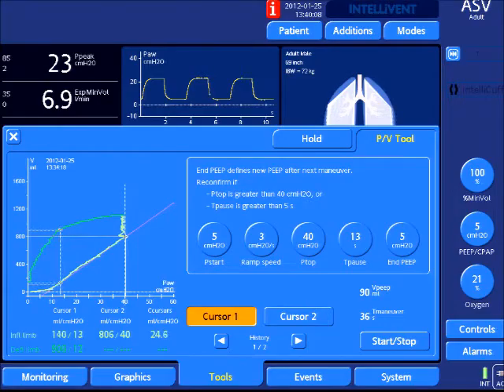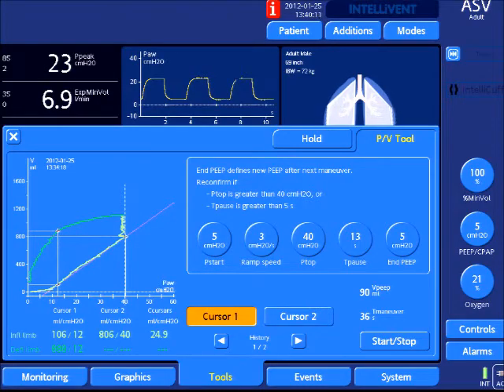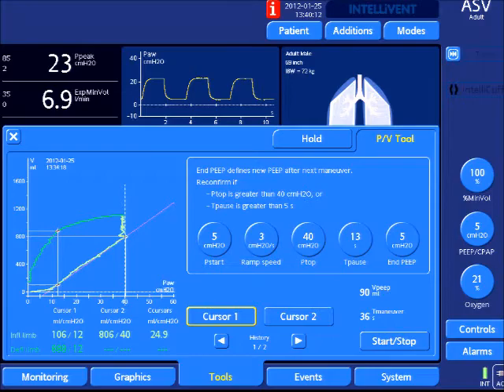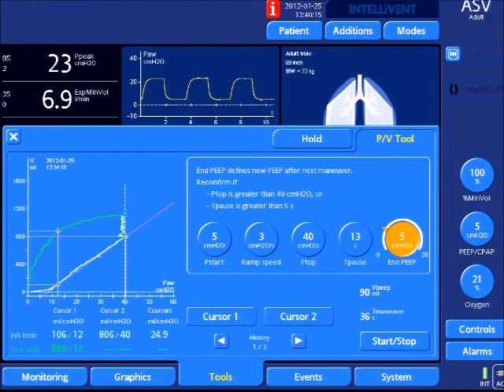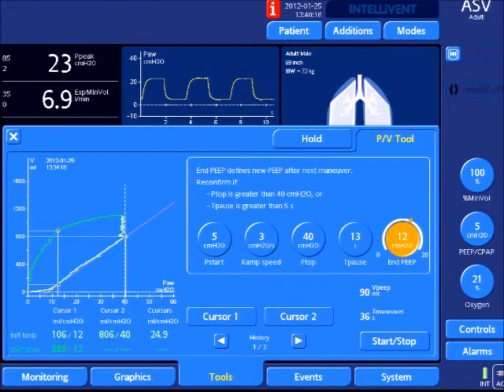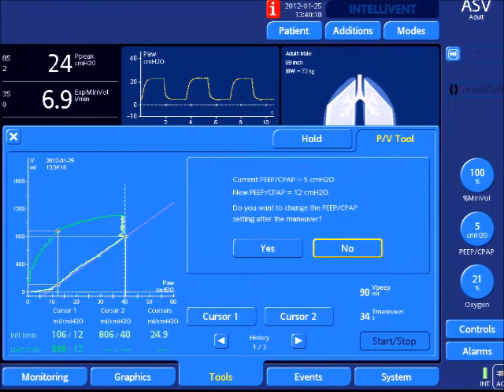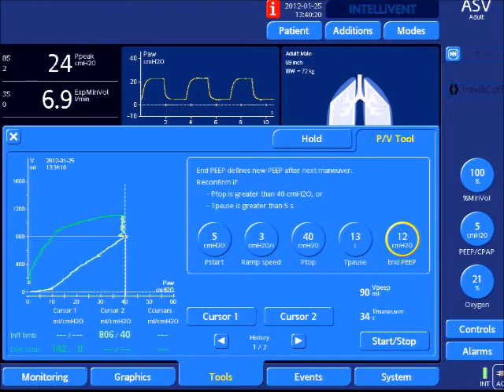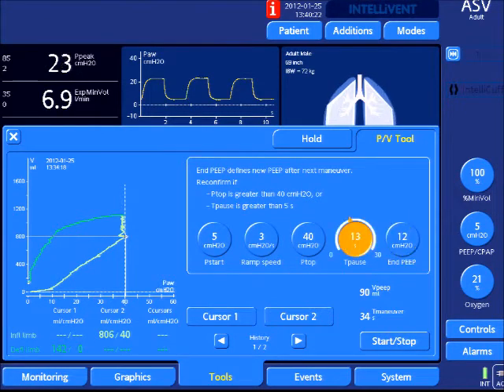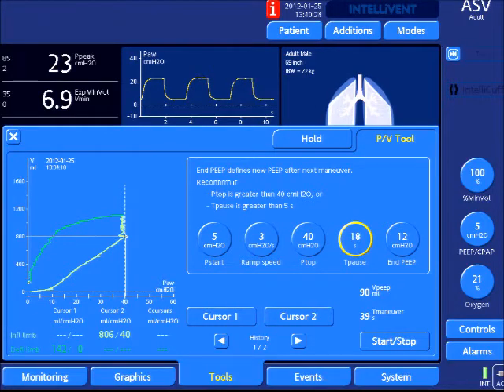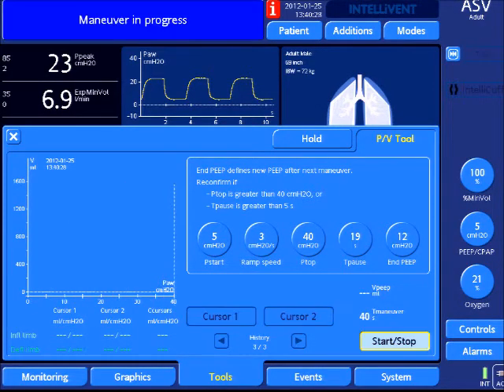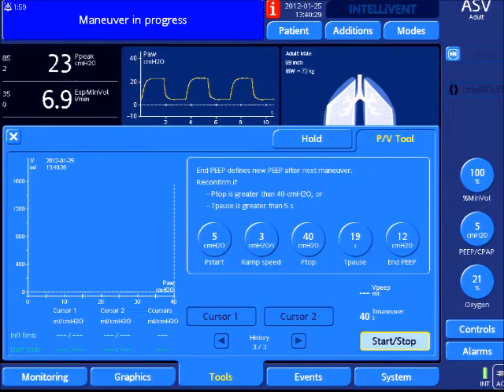Just evaluating the last maneuver to see where the lower inflection point was. This is around 12 centimeters of water, so we want our ending PEEP at 12 centimeters of water, and that's what he's setting. Changing the inspiratory pause to see for recruitability. I'm going to start the maneuver.